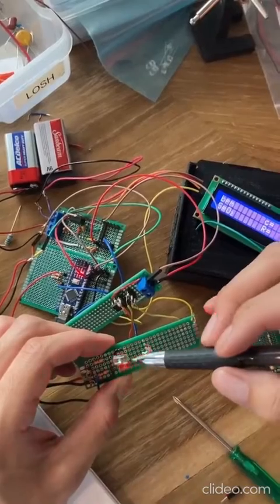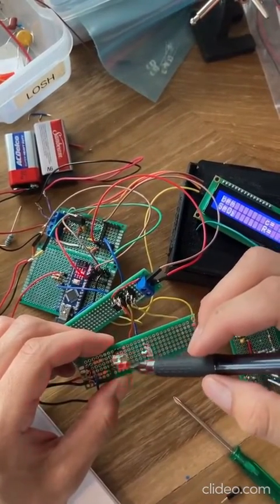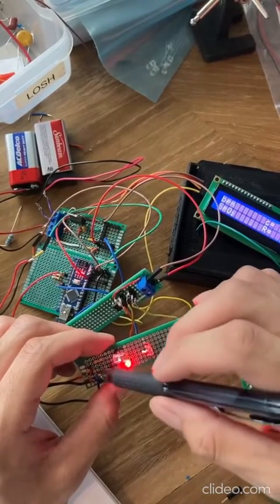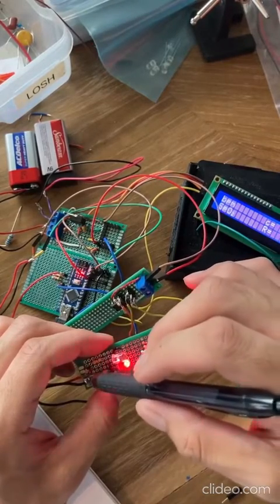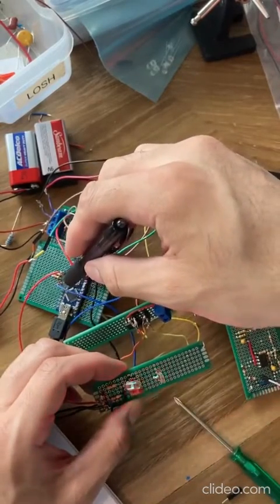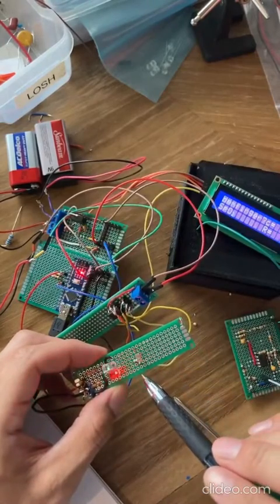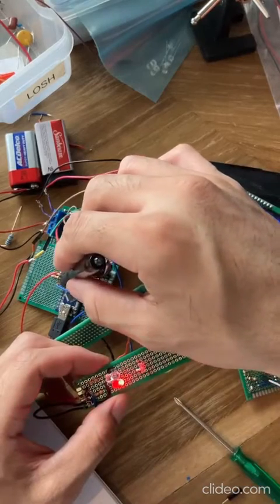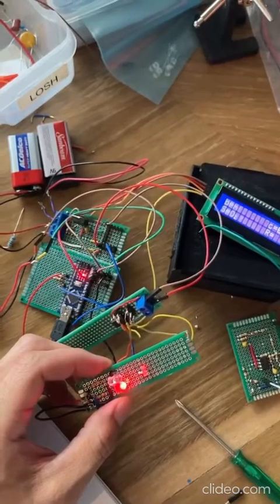The optical module consists of 2 resistors, 320 ohm, 2 LEDs, infrared and red LED, and a photodiode. The 2 LEDs are pulse width modulated from the microcontroller at pins D3 and D4. The output of the photodiode goes into the analog pin of the Arduino, where it then senses and processes the signal.